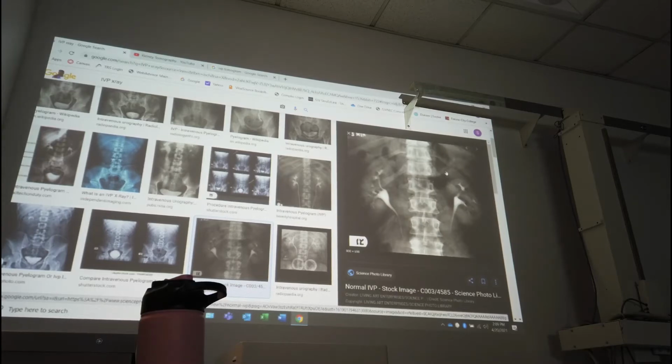I imagine somebody sticking a catheter through your urethra and then pumping you full of contrast. And then sometimes they make you pee. Okay, go ahead and pee now, and I'm going to take a whole bunch of images as you're peeing. They're called VCUGs, voiding cystourethograms.